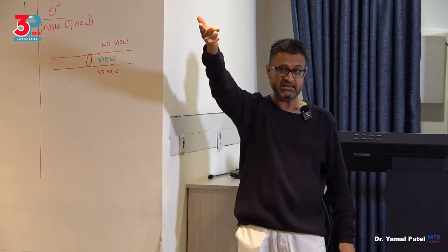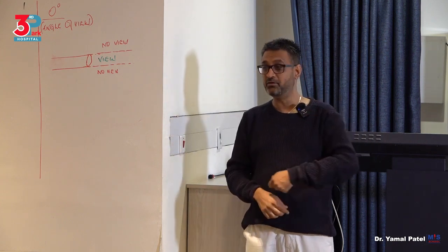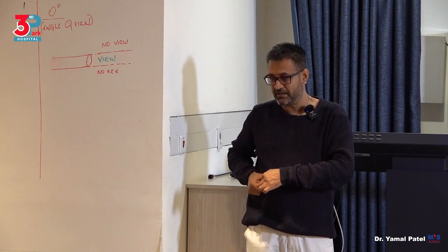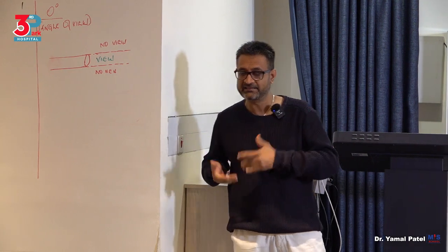That's what happens in our surgery when we use the monopolar pencil. You burn here, and then here it's returning. You're not reducing how much energy is here and how much is here. What you have done is small surface area, big surface area. This does not burn, this burns.